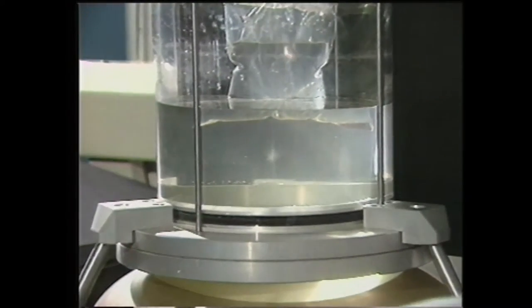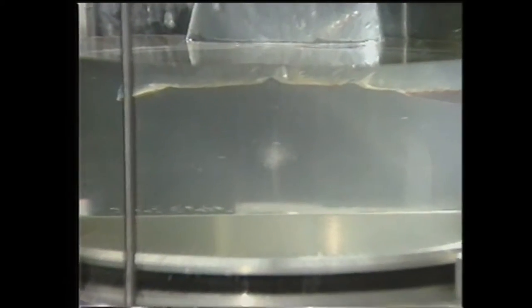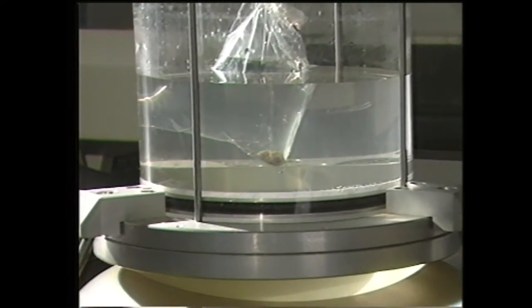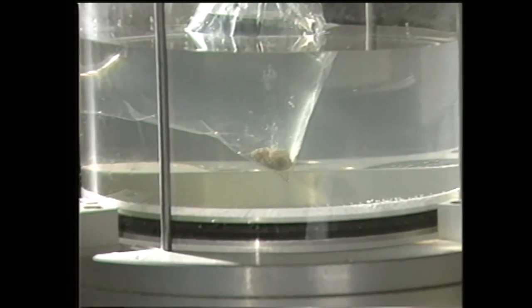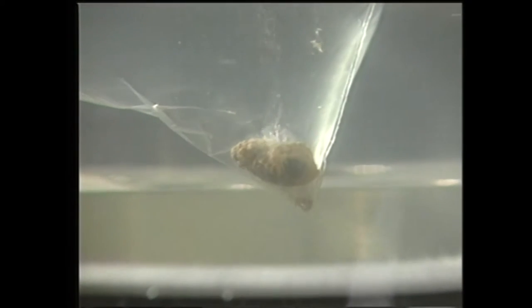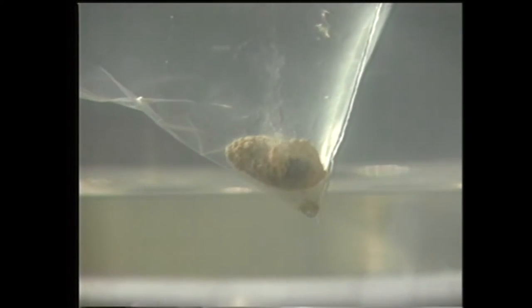Ces images montrent une représentation in vitro du point d'impact des ondes de choc piézoélectriques. Ces ondes élastiques, dont on peut varier la fréquence et l'intensité, sont produites par 320 quartz placés dans un cône qui les focalise sur un point fixe.